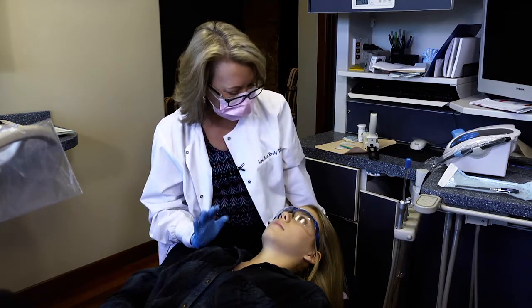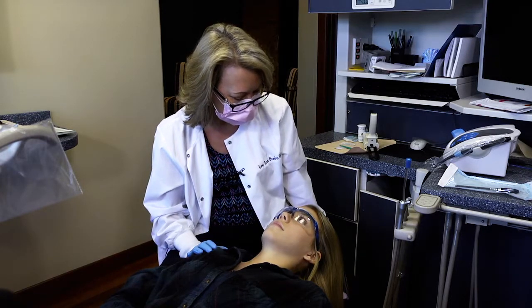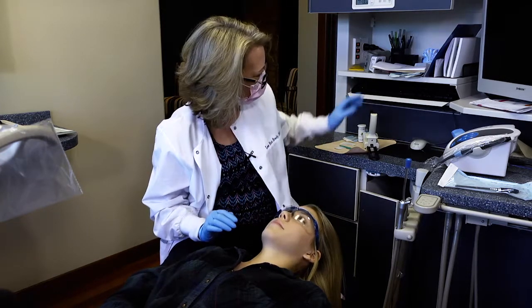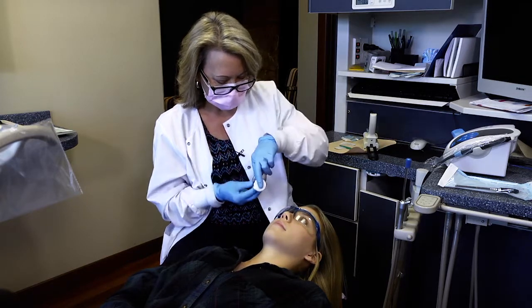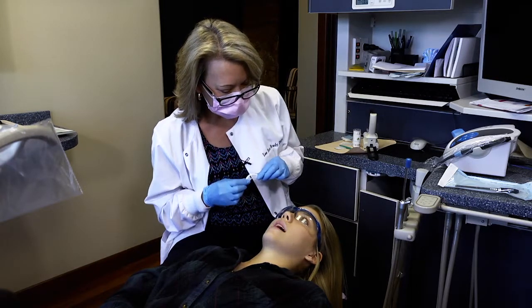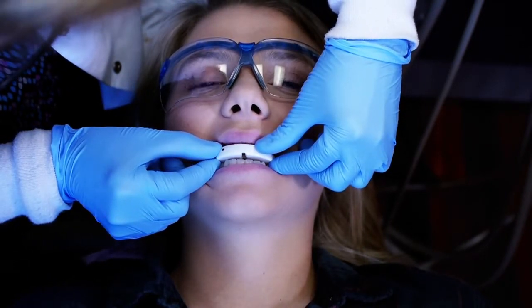And I'm going to give you a whole list of instructions, and they're actually printed out for you so you don't have to memorize them. And using your QuickSplint is going to be part of that protocol for the first few days after your visit. Okay? So the very first thing I'm going to do, Jenna, is I'm actually going to just get the little device. They come for us prefabricated, and I'm actually just going to position it over your teeth and have you just bite your teeth together so I can see how it works. And go ahead and bite for me.